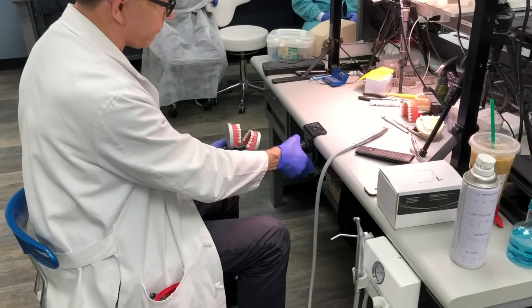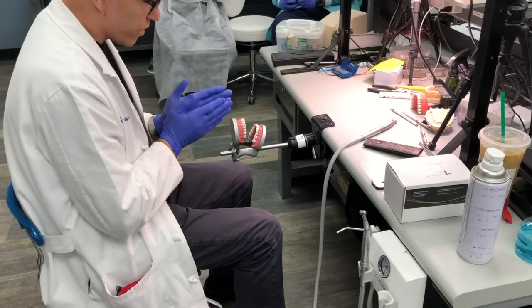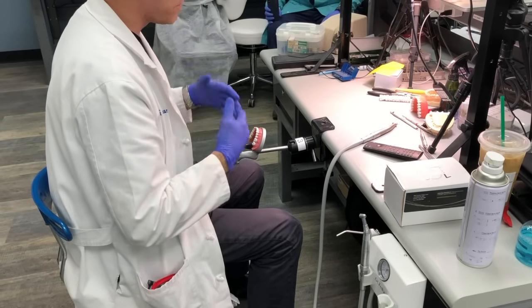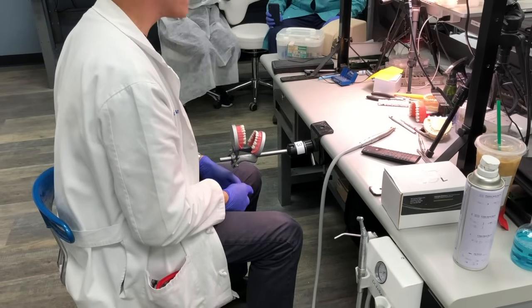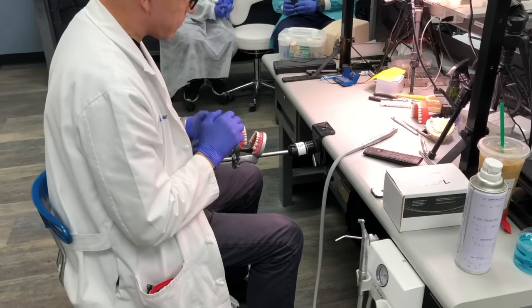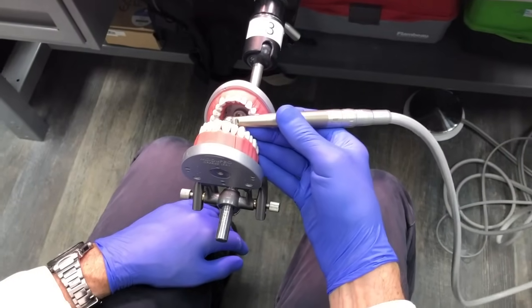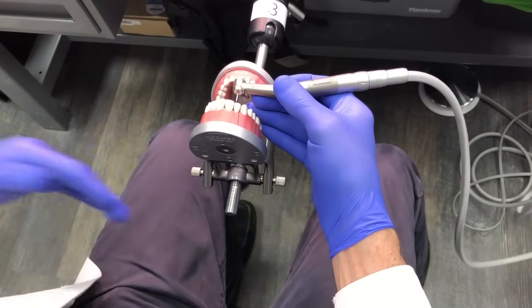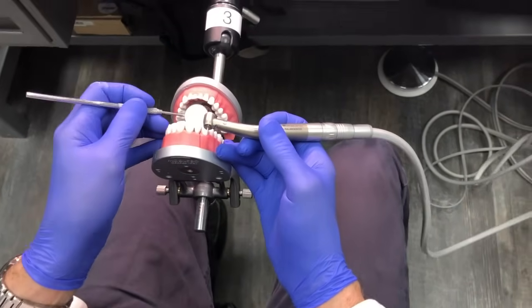When working from the supine 12 or 11 o'clock position, you can stare straight at the teeth and do whatever work you want. It's perfectly acceptable not to use a mirror when it doesn't make sense — you may use the mirror to retract, but not necessarily to see. For example, doing facial reduction on tooth number eight, I don't need a mirror; I can work straight on from this position. But when I get to the lingual, that's when the mirror comes into play.